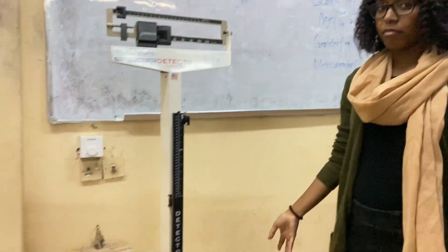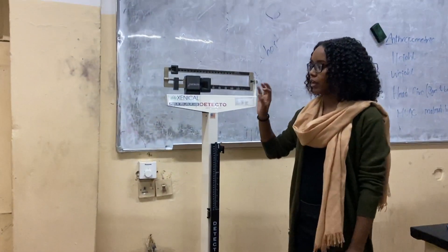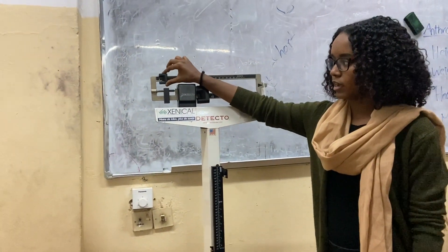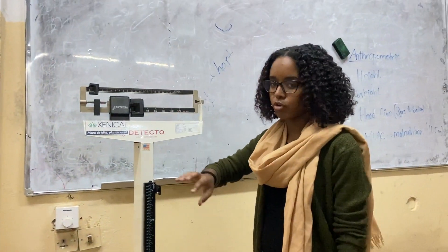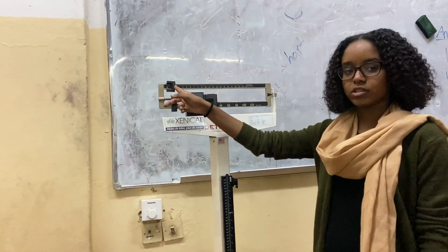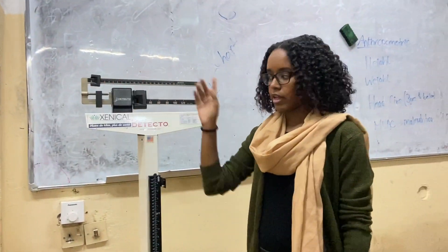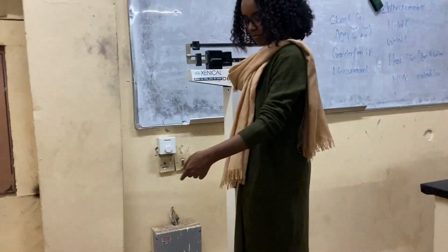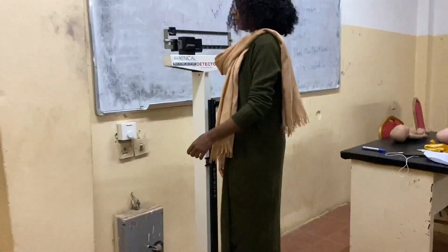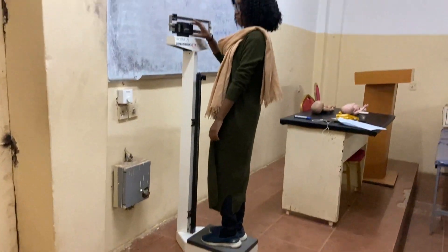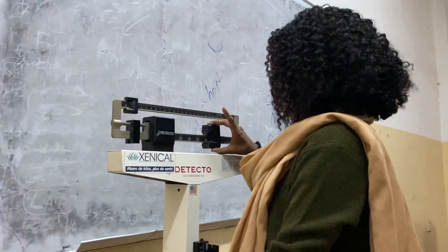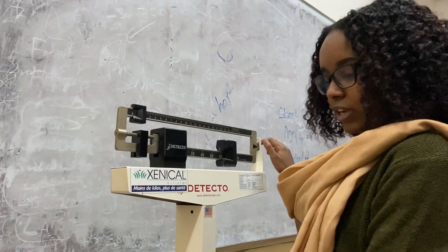This is the scale for the height and weight. The most important thing is to always make sure that the smaller one is at zero. So, make sure you take the smaller one to zero. Then you ask the patient to step on it. You're going to be moving the big one — move the big one more than the weight of the patient.